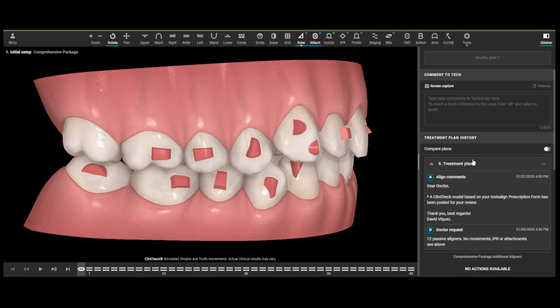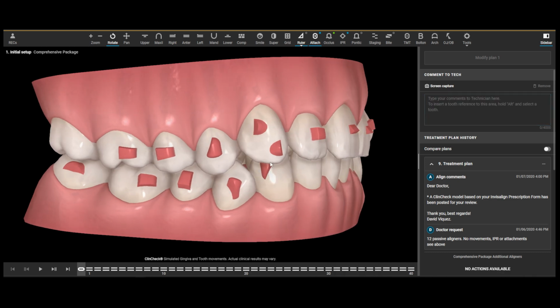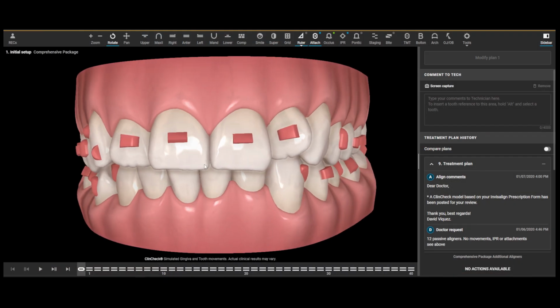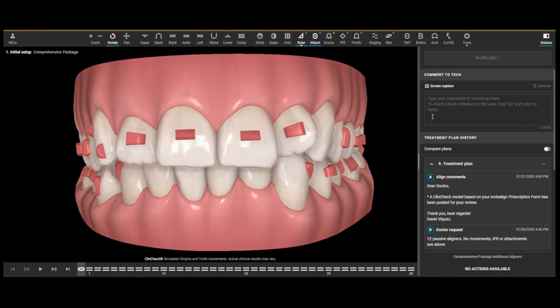Now, one thing that I will do on pretty much all of my ClinCheck plans is use a checklist. This checklist is designed to help us walk through step by step all of the considerations with this particular case. This particular one being a TAD case may have a few extra things that don't fall on that checklist, but for the most part, the goal is that you have something you can review to make sure that everything was done properly.